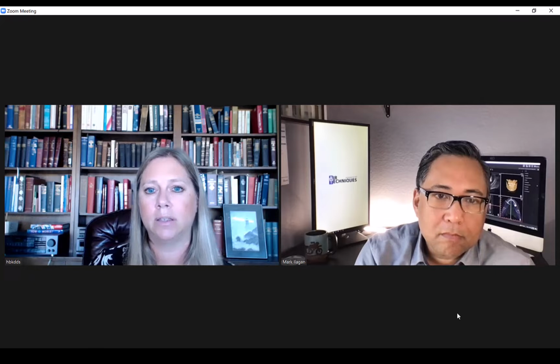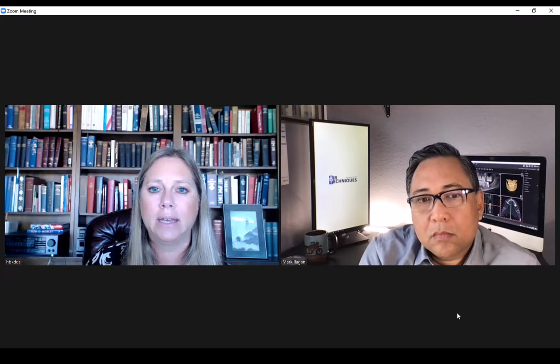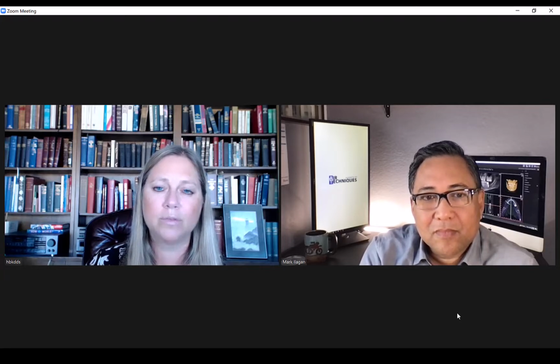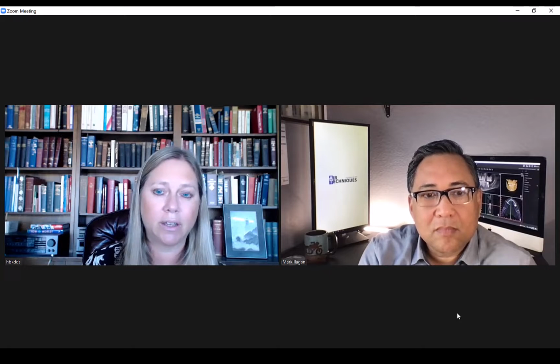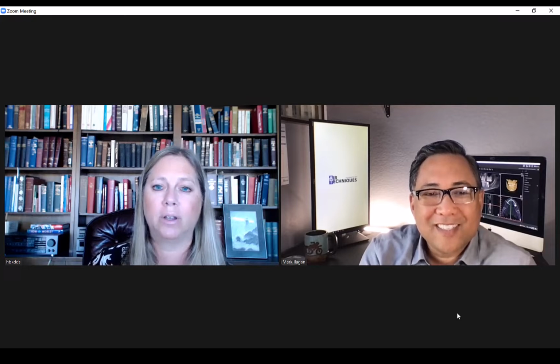So for whoever has read the CBCT, I do work with a group, and I know how everybody was trained. Everybody's from UNC Chapel Hill, and everybody has extensive years of reviewing CBCTs and education. For instance, my program director from UNC Chapel Hill retired and came to join me, and he is an amazing individual that has done the dosimetry for almost every CBCT that's on the market. And he's still working on that kind of stuff. So yeah, I have a great team that works with me.